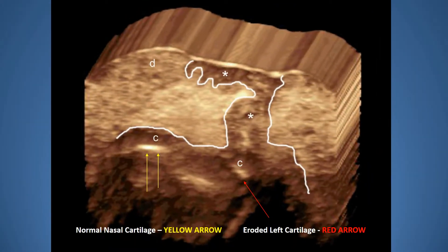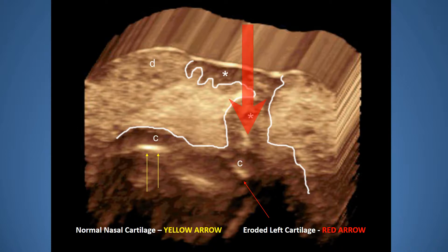Here we notice a basal cell that's destroying the cartilage — it's called an hourglass basal cell. The stars show where it started, but then the tumor goes down like an iceberg and starts invading the cartilage. This is very important to know preoperatively.